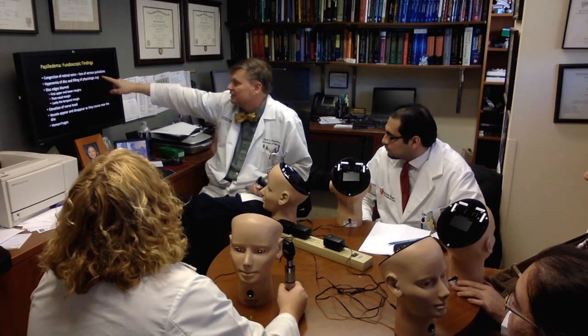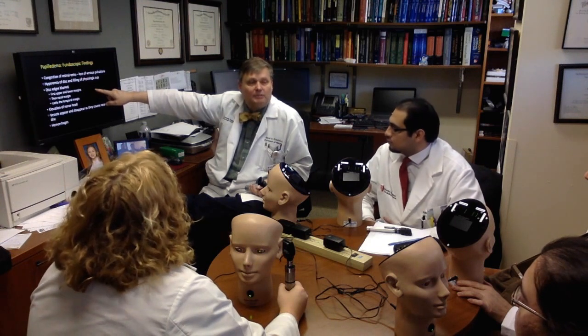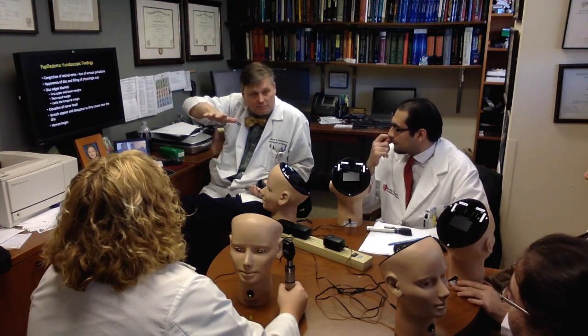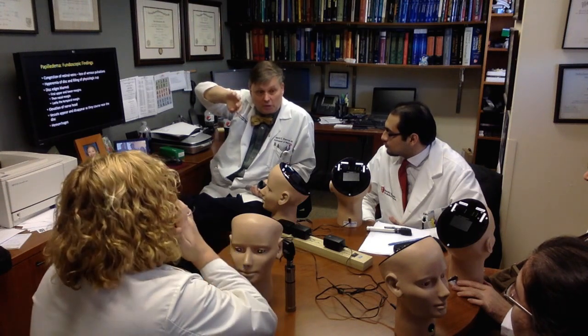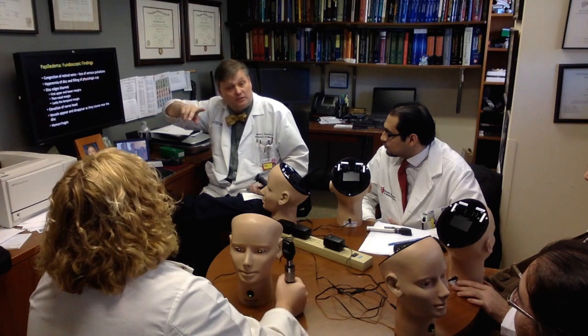Often the physiologic cup gets filled, and the disc gets blurred. But here's the thing. It tends to happen first in the superior and inferior margin and the nasal margin. The temporal, which is the easiest to see, is the last one to go. In addition, the nerve head elevates. That's the big thing.